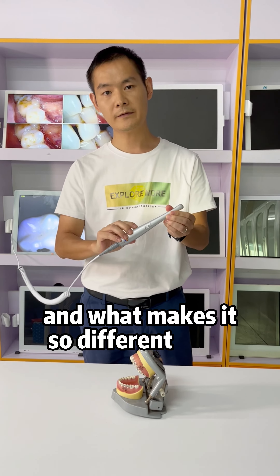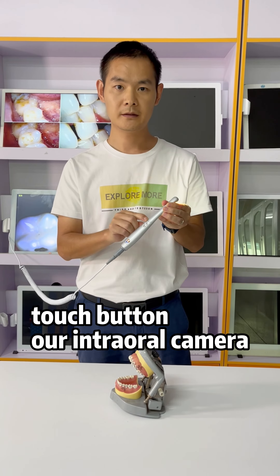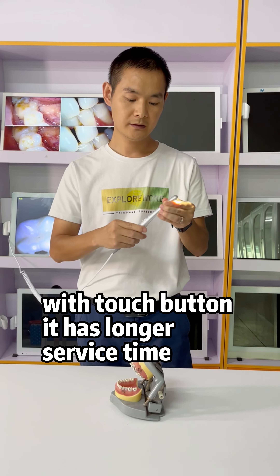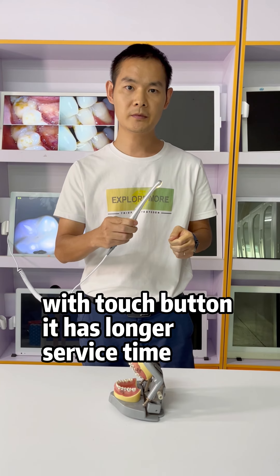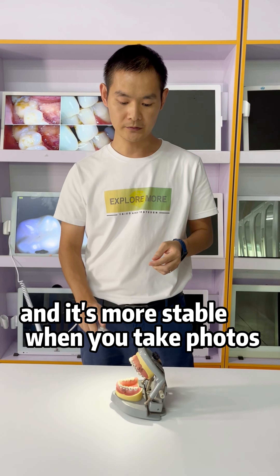Hello my friends. Today I want to show you our intra-oral camera. What makes it so different? It lies in the touch button. Our intra-oral camera with touch button has longer surface time and it's more stable when you take photos.